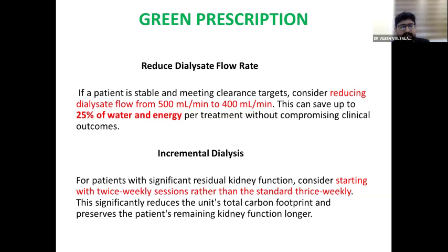You are trying to just conserve 100 ml per minute in this particular step, and this can save up to 25% of the water and energy per treatment without compromising the clinical outcomes. This is a very simple step which you can do.